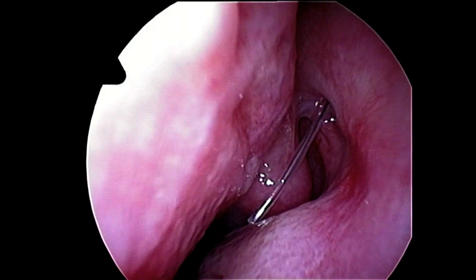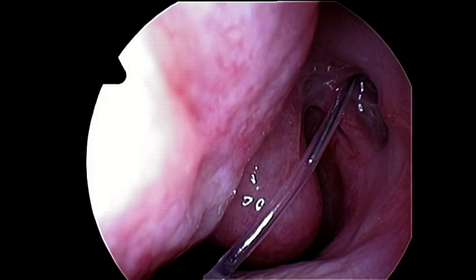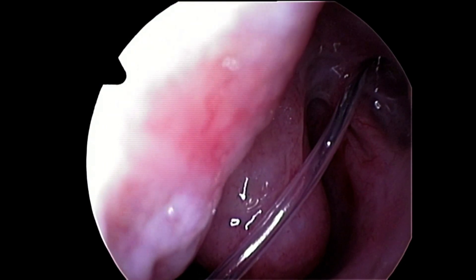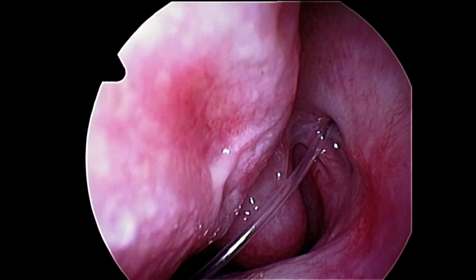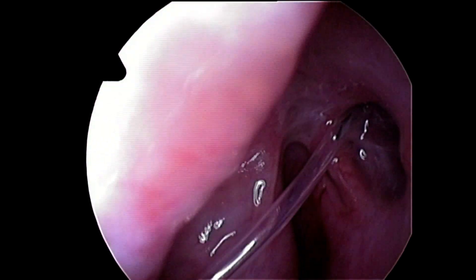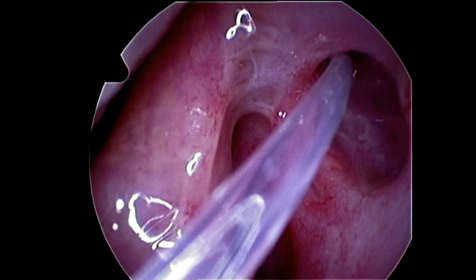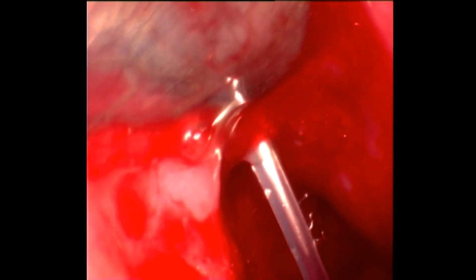A successful pushed intubation with the Master Ka can be further validated through an endoscopic view. Here we see a Master Ka intubation during a DCR procedure, which indicates that the silicon tubing does not retract while removing the metallic guide. With nasolacrimal duct intubation, an endoscopic view of the inferior turbinate can also demonstrate the same finding: the Master Ka tubing stays in place while the guide is removed.